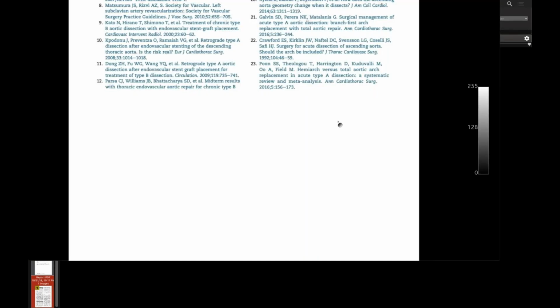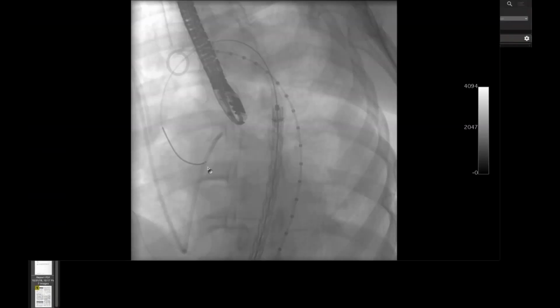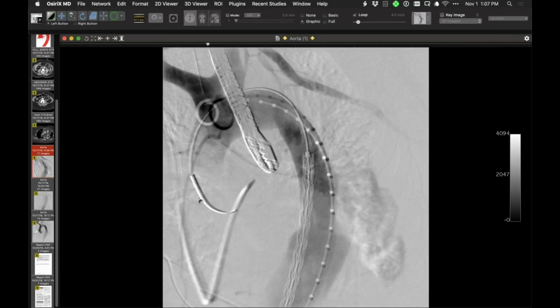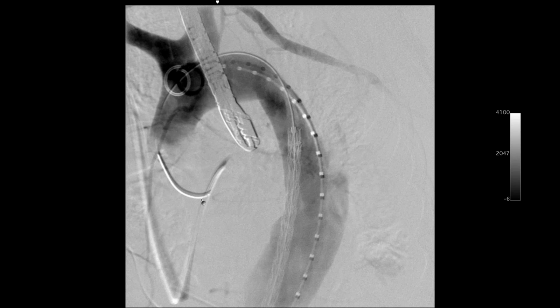And this is what they did in this patient. So I will show you that they went in and put in a stent graft, and you'll see the placement of it there. Yeah, Howard, go to full screen again. That seemed to fix the problem, and when it's not, then it jumps. Yeah. Okay, I'll try to stay in full screen.